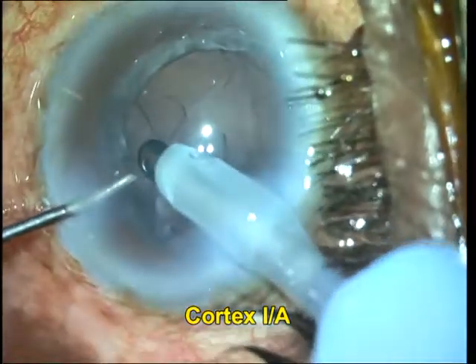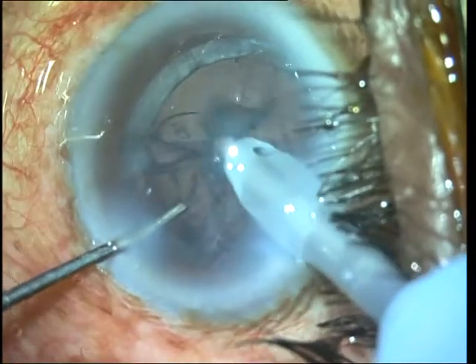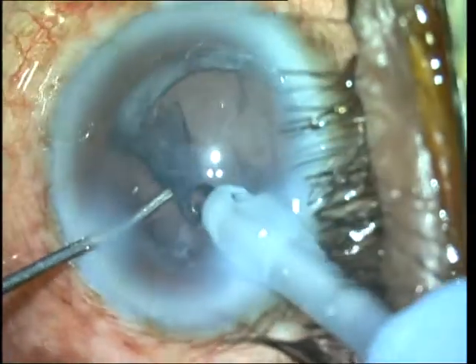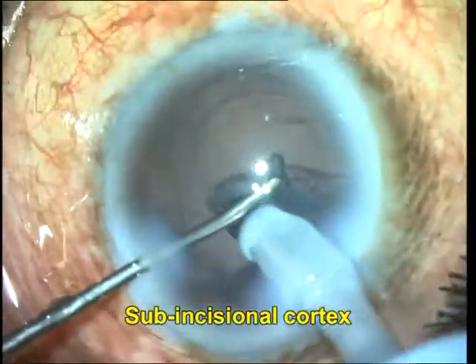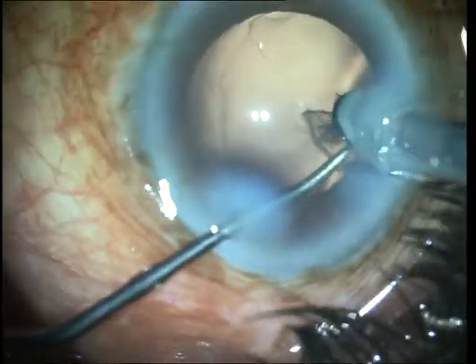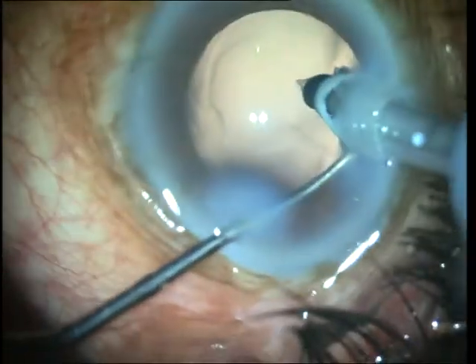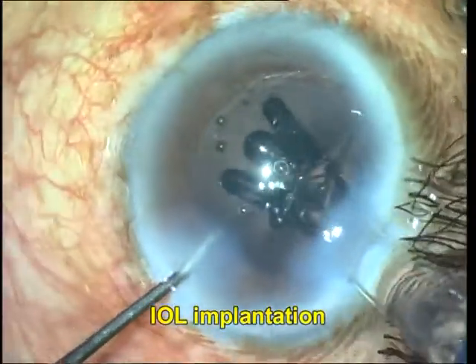Once the nucleus is completely removed, it's time to remove the cortex. You will notice that since the femtosecond laser cuts the subcapsular cortex in line with the rhexis, the cortex is actually clean cut with no wisps of cortex that phaco surgeons are used to grasping when doing a manual rhexis. Therefore, cortex aspiration can be a little more difficult with FLACS compared to a manual rhexis, because of the absence of these wisps.